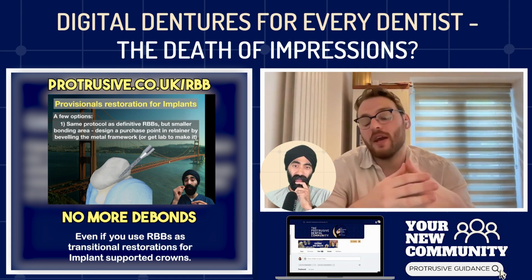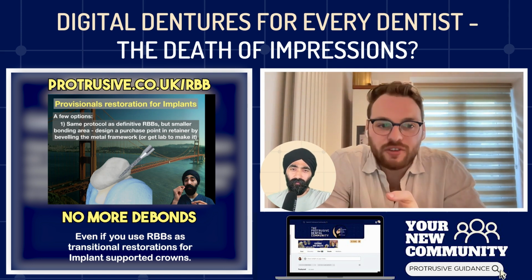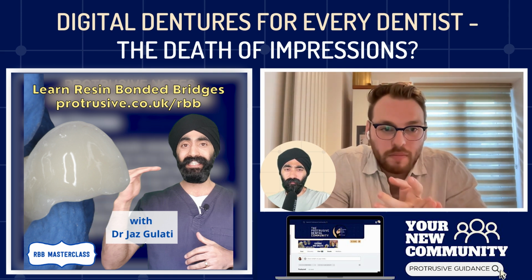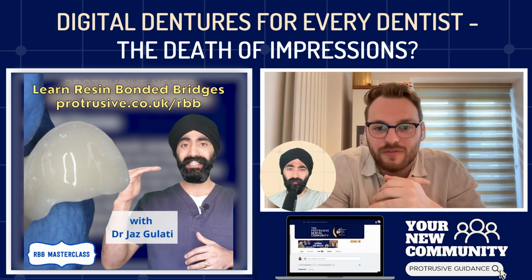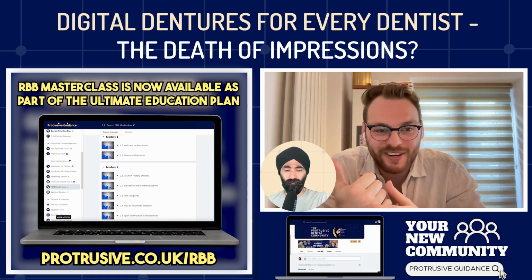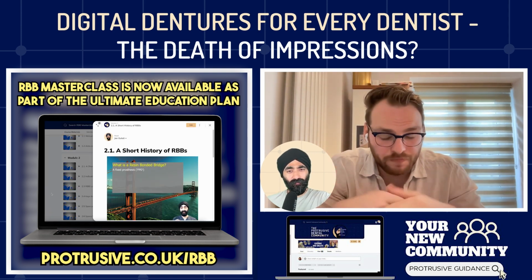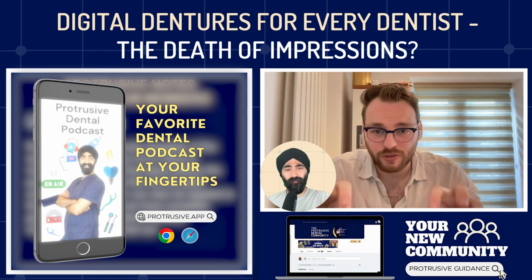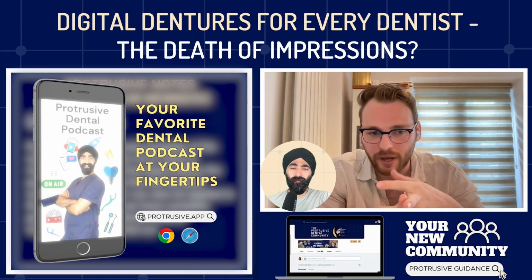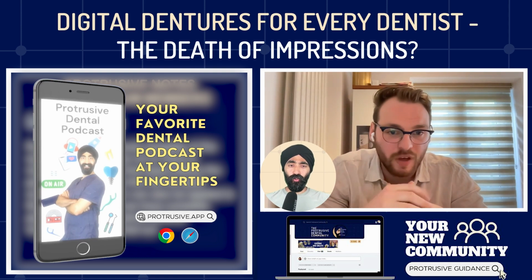Yeah, absolutely. From our perspective, chairside, fully digital, and I find you've got a nicer accuracy with the fit. Then we always do a verifier, so we either mill or print a copy of the denture out of an acrylic material so that we can check that our scan is accurate, because our chromes are pretty pricey, so I don't want to have to make those twice. So we check that's accurate, great. That's our appointment 3. Then you can do a tooth try-in on top of that as well, if you like. You mill this little framework and it clicks in with some teeth on it, so the shade's right and the bite's right. Then the chrome gets made, and then you fit. So that would be our five appointment protocol there.